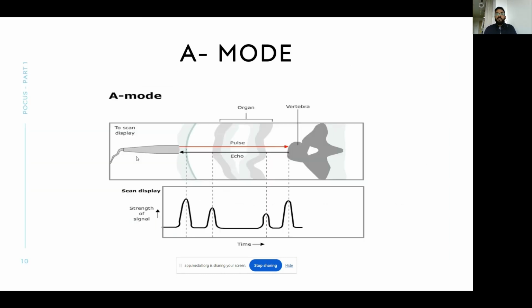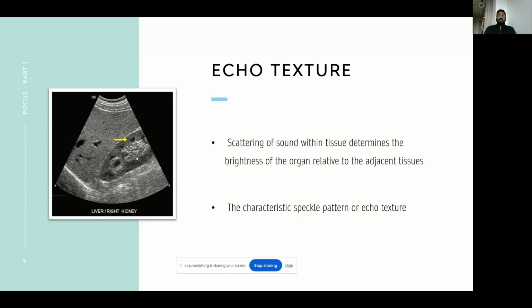And now, before I go any further, I want to tell you that we have so far discussed that ultrasound is being sent out by the transducer. The echo is then picked up by the transducer, the pulse echo principle, right? Now, even though the echo is being picked up by the transducer, how we use this echo, that is how we analyze this echo and how it is represented in the image, will decide on what type of ultrasound you have or what mode of ultrasound you have.